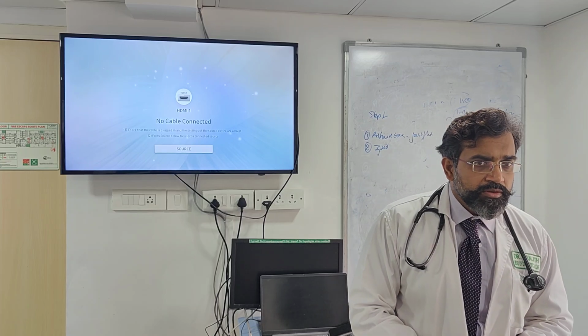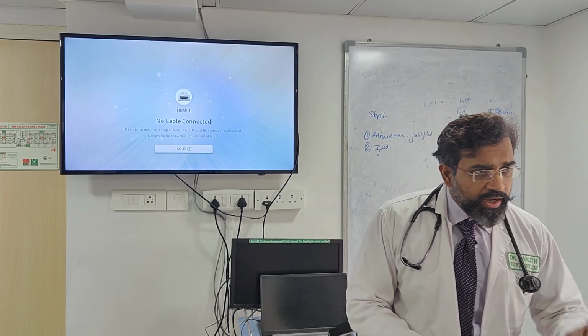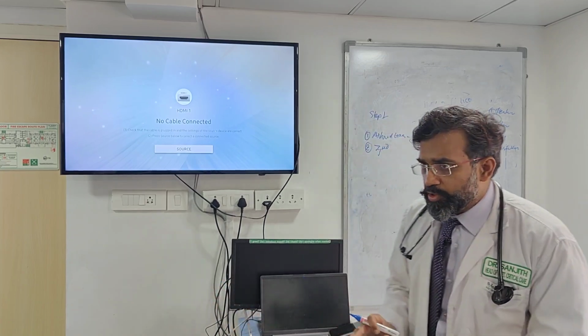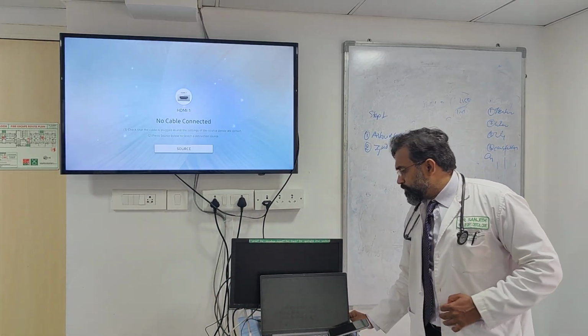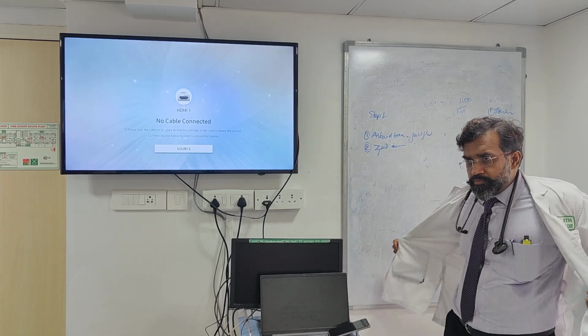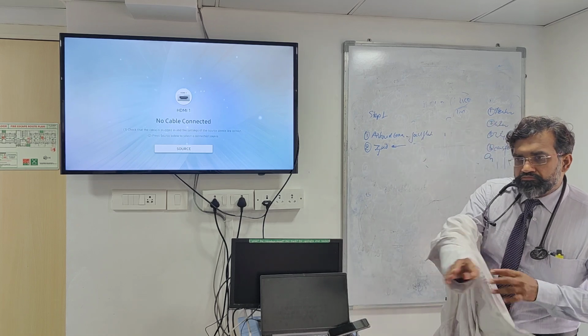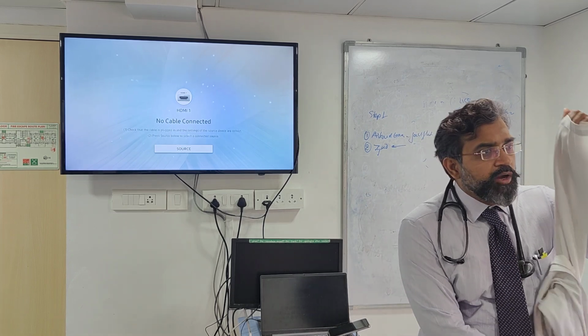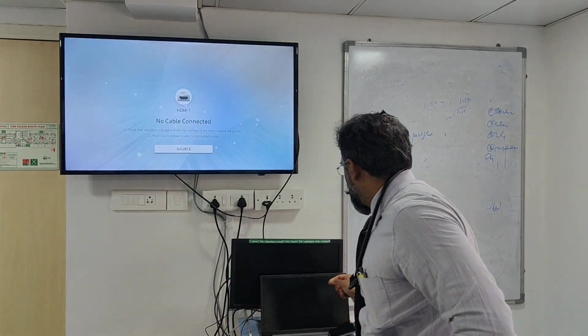Okay? Clear on this? Clear the zero? So in our category of how do you zero your patient? The next step is how do you zero? Niharika, how do you zero? We'll put the knob open to air and then select zero. No, how do you do zero? Amit? Always from zero. How do you do zero?